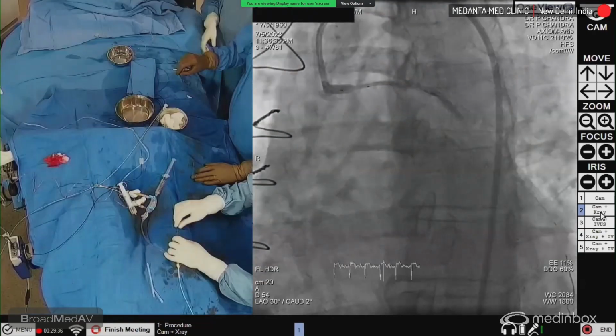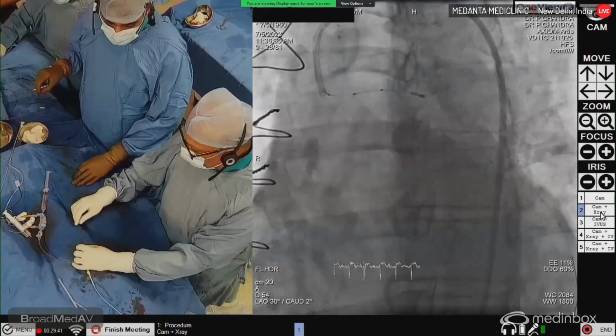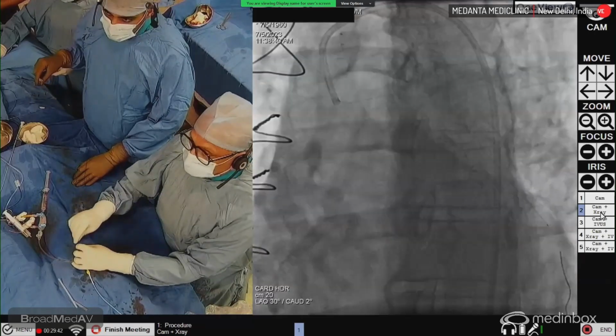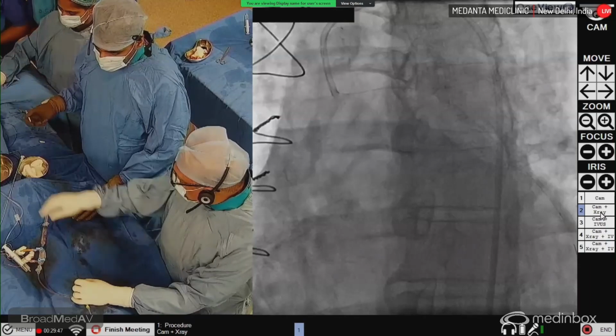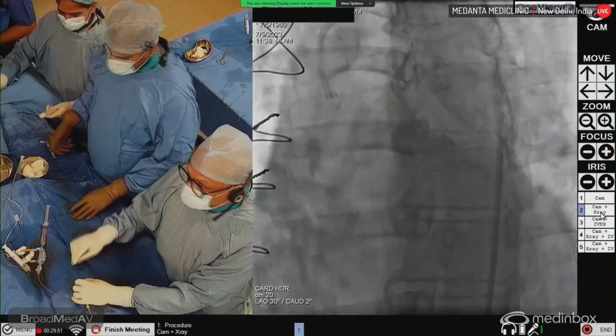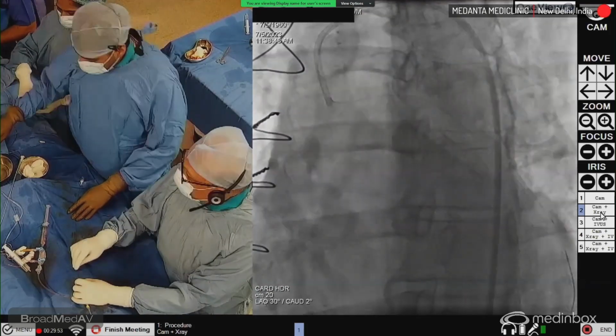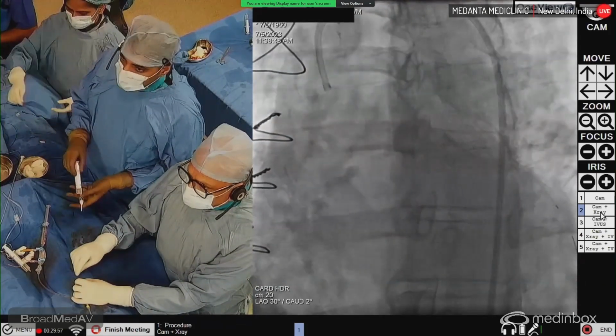We still do not have much information about the use of drug-eluting balloons in the vein grafts. Maybe one day we will have to do drug-eluting balloons here. But before drug-eluting balloons, we still have to get a lumen, and to do that, if you use a cutting balloon, there will be higher chances of distal slow flow, etc. So let's see how it goes.